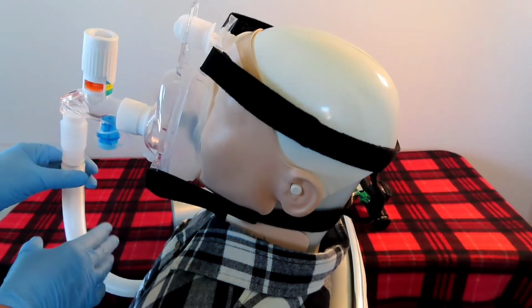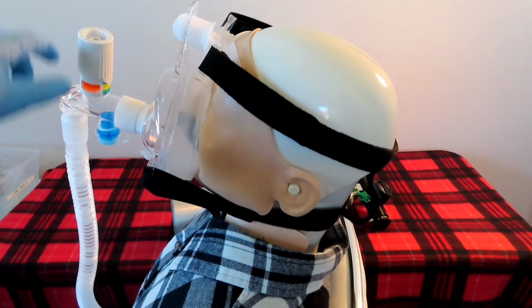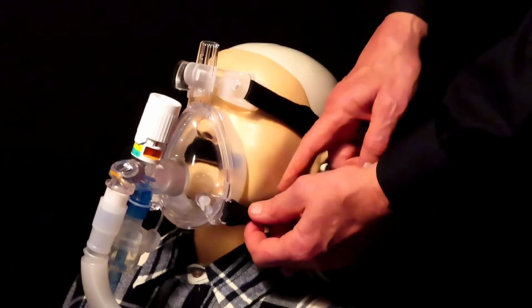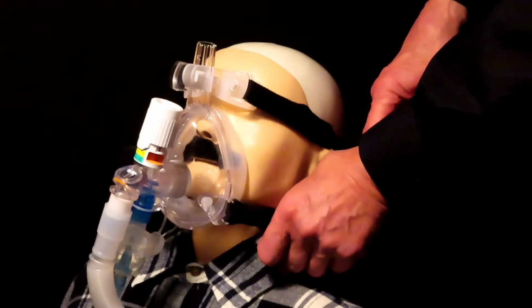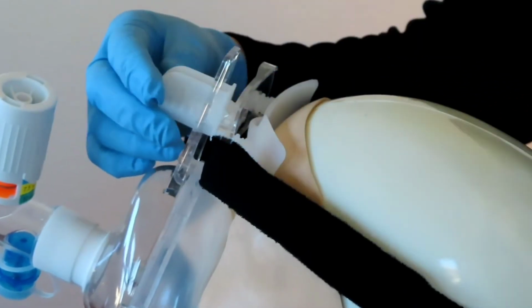If needed, you can pull on the corrugated tubing to make sure it extends the distance needed. Make sure that your PEEP valve is at 7.5. Once the patient is stable and comfortable, you may adjust the tension on the mask by tightening or loosening the side straps all the way around to increase or relieve pressure on the temple area. Squeeze these two levers here and make any adjustments that you need.